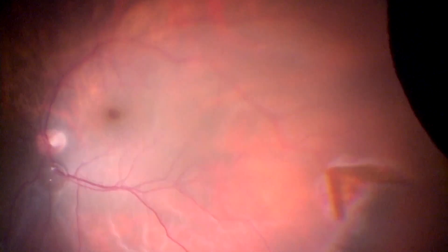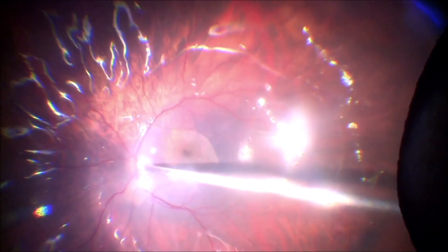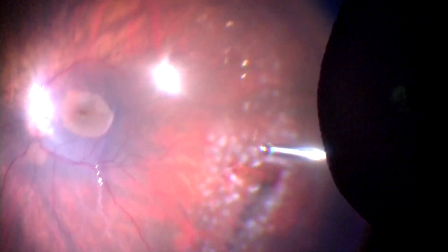This is a case of a retinal detachment with a horseshoe tear along with a macular hole. Brilliant blue dye is used to stain the ILM. After this, PFCL is injected and ILM peeling is done under PFCL. At this stage, we use the massager to relax the edges of the hole. Air fluid exchange is done and once the retina is flat, laser is done around the tear.